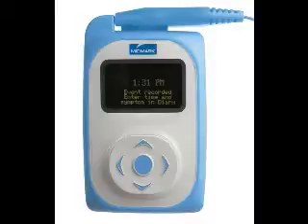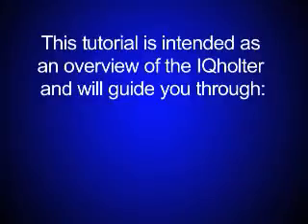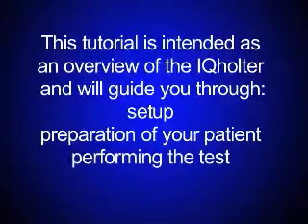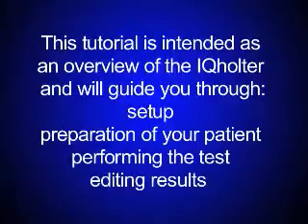The IQholter system provides a compact digital recorder with 3 powerful software applications providing the complete information and analysis you require. This tutorial is intended as an overview of the IQholter and will guide you through the setup, preparation of your patient, performing the test, as well as editing results.